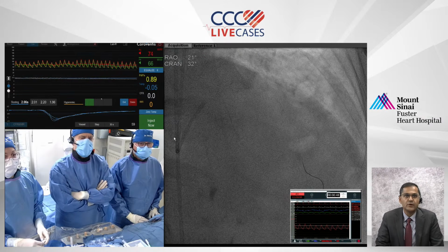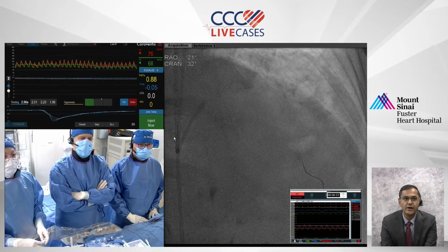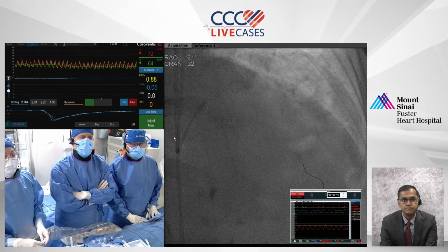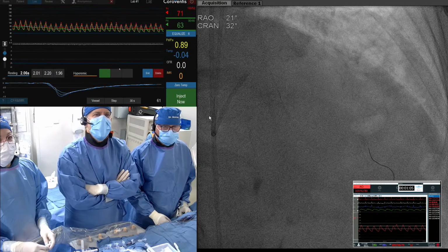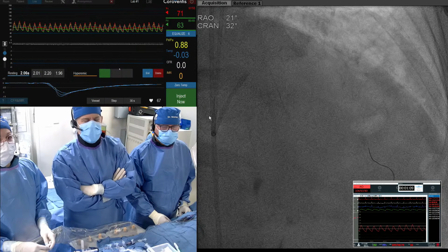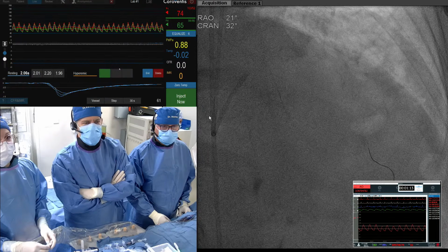I think Jay Widmer in Texas has done some bolus injection of adenosine, but to me, we get steady state hyperemia really easily with an IV infusion. So here, her heart rate's up a little bit, you can see a little bit faster, and a little bit of separation with the green and red, the PDPA. Usually we see hyperemia at about a minute, a minute 15, 20 seconds, so we'll give it a full 2 minutes.